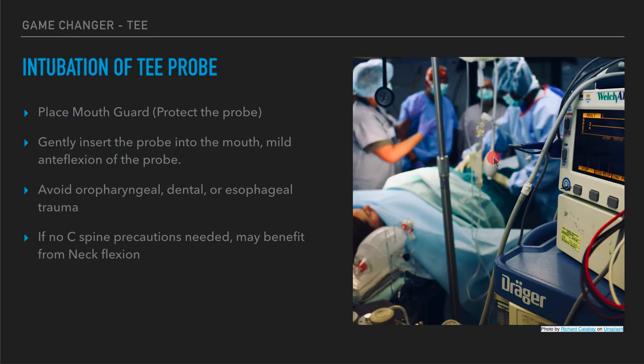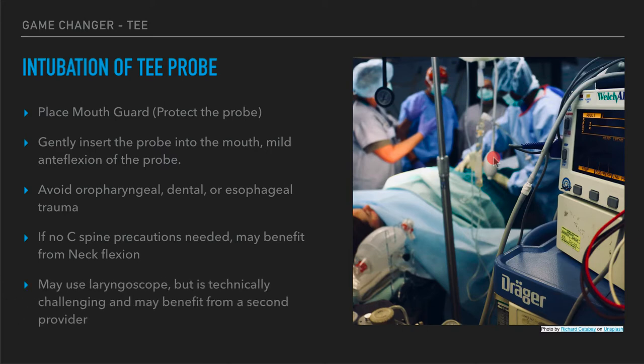If there are no C-spine precautions needed, you may benefit from a little bit of neck flexion to help get the probe down into the esophagus — similar to placing a nasogastric tube, a little neck flexion can sometimes help. If you have multiple hands or many people helping with this critical patient, it may benefit you to use a laryngoscope to get the probe in if you're having challenges with insertion. I'd recommend doing this with a second provider because there really aren't enough hands to do it all.